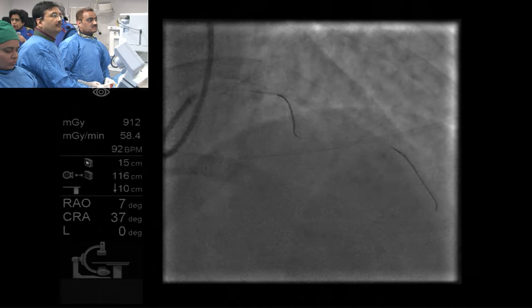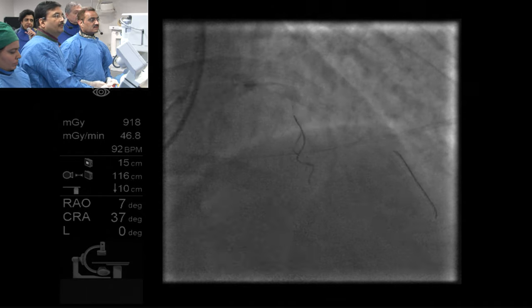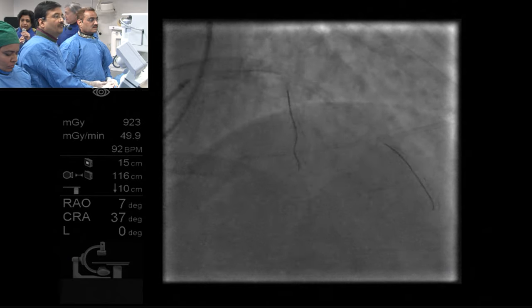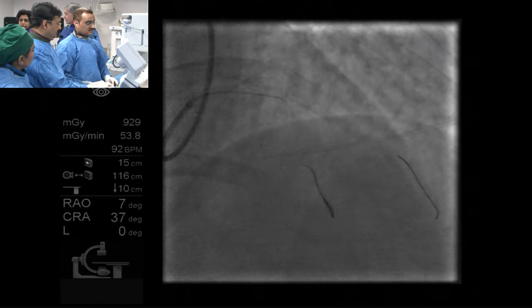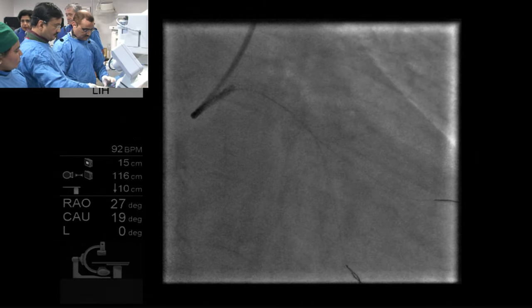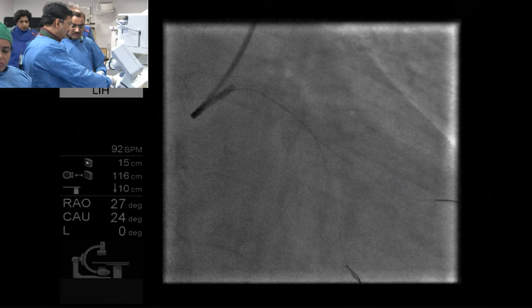But you still do optimization after you deflate the balloon and the stent balloon. Right, you need to optimize. You need to optimize, absolutely. But one question is that if you inflate both the side branch balloon as well as the stent balloon, and then you remove the side branch balloon, if the results are optimum, can't you just do an optimization and not do a kiss, or is a kiss mandatory? No. We don't need to do the kissing, right? Kissing is not mandatory, but optimization is mandatory. Because the main branch stent balloon is inflated only at 8 atmosphere, so after withdrawing the side branch balloon, we should further inflate the main branch stent balloon and keep the stent balloon in position tightly.